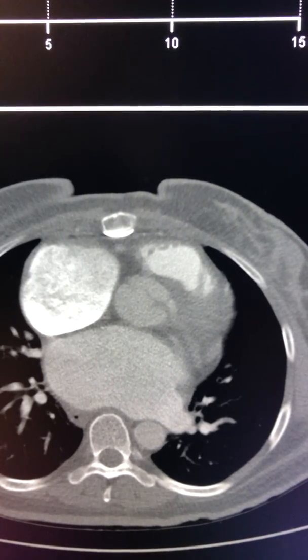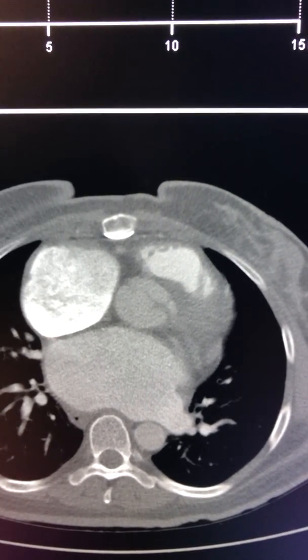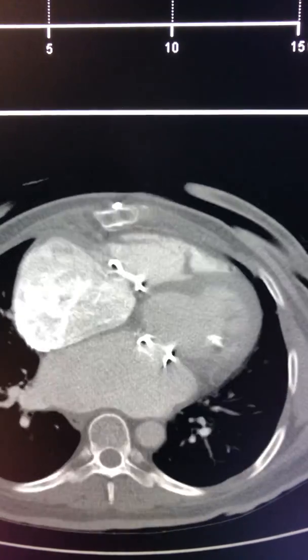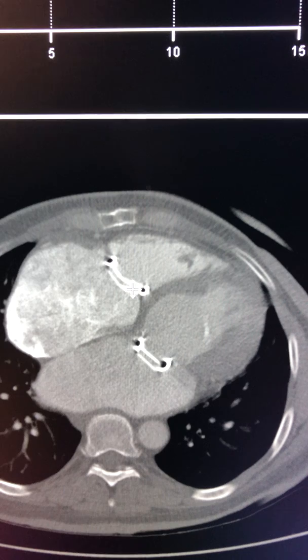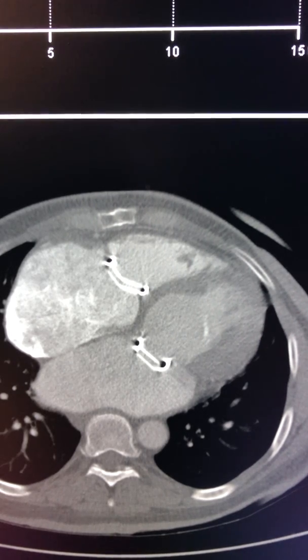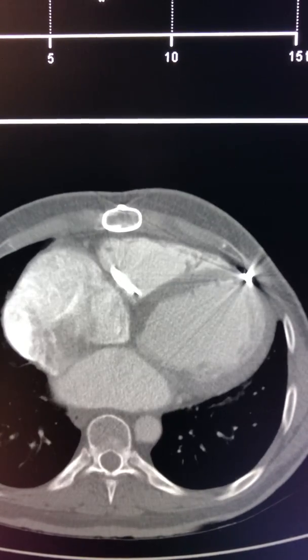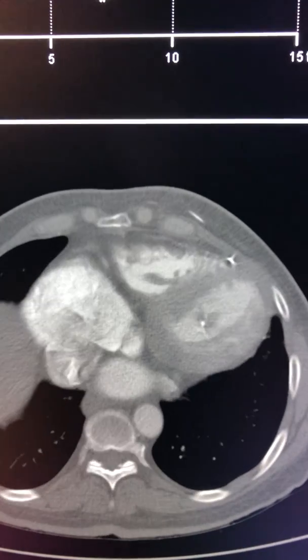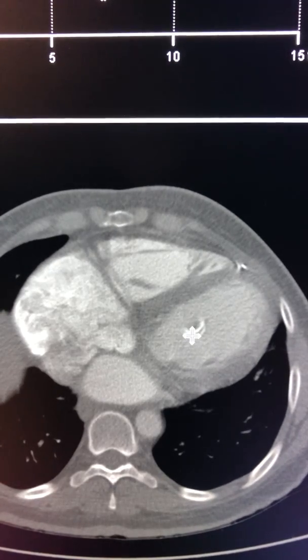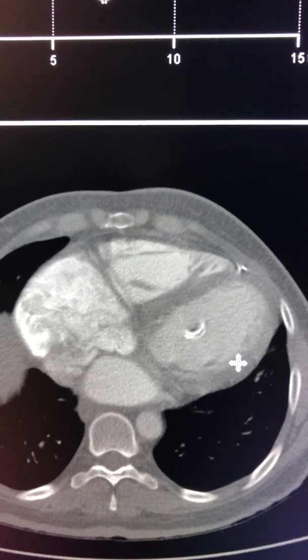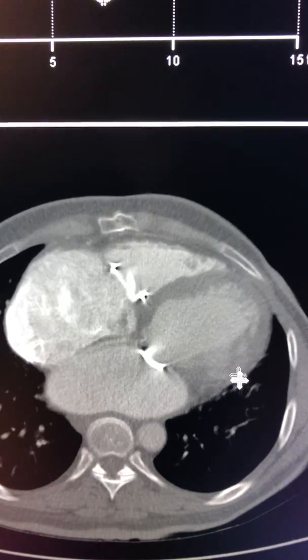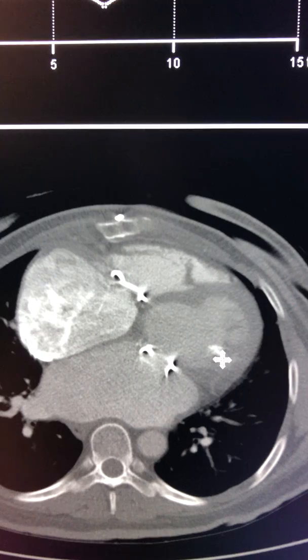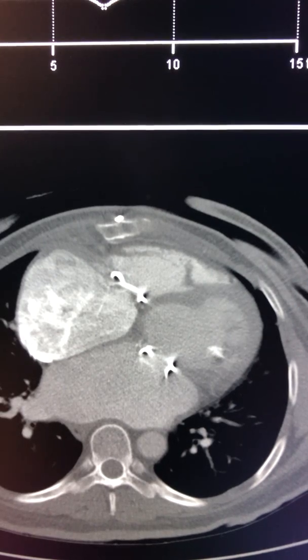This is a particular type of calcification that occurs in the heart. This patient has mitral and tricuspid valve replacements as well as biatrial enlargement. But if you look closely in this region, there are some faint curvilinear calcifications which appear to be within the left ventricular chamber.